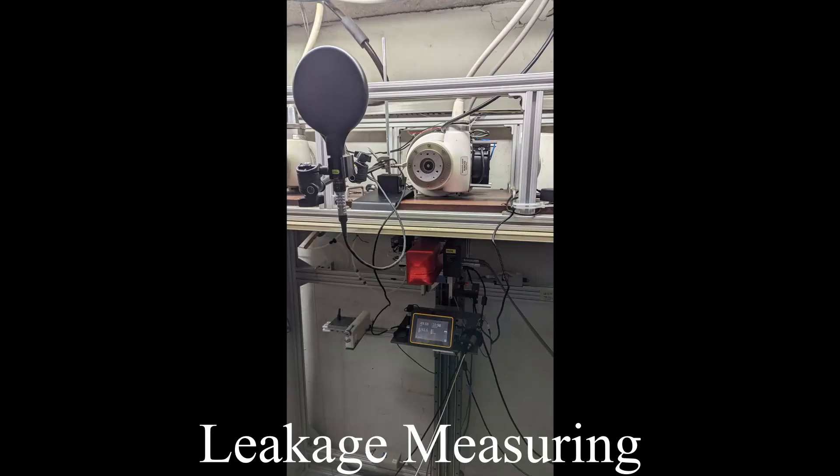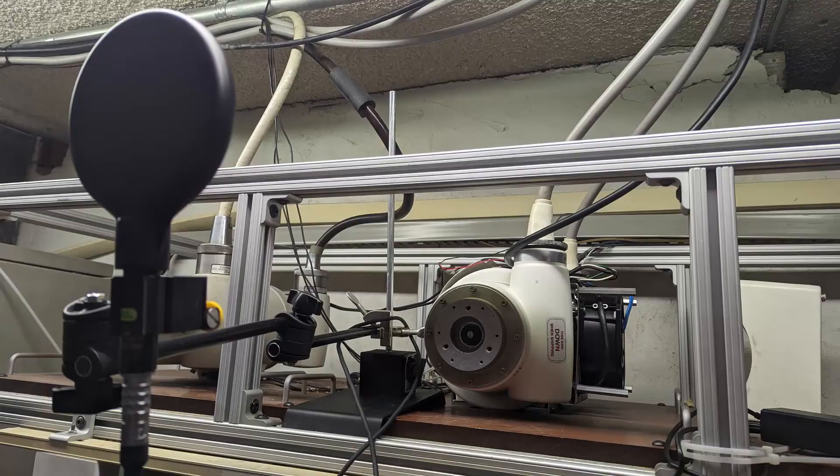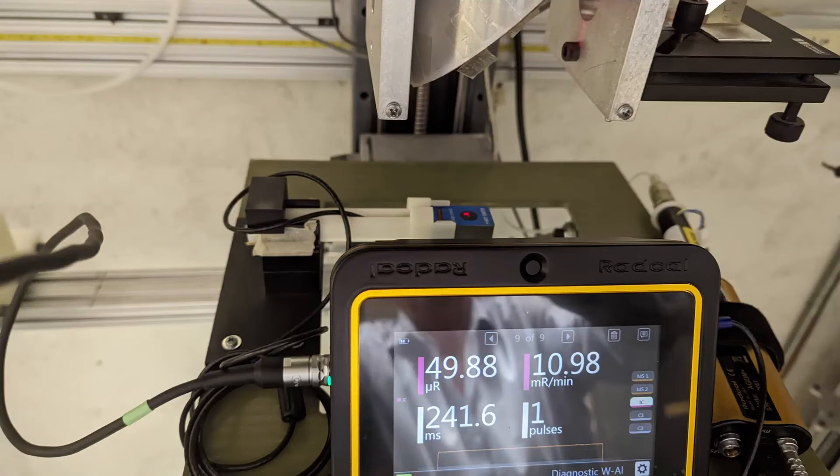Leakage measurements can easily be done with the 180cc scatter chamber. Fixturing of the 180cc chamber is recommended for these sensitive measurements. It is also recommended that a solid state detector be used as a trigger source.